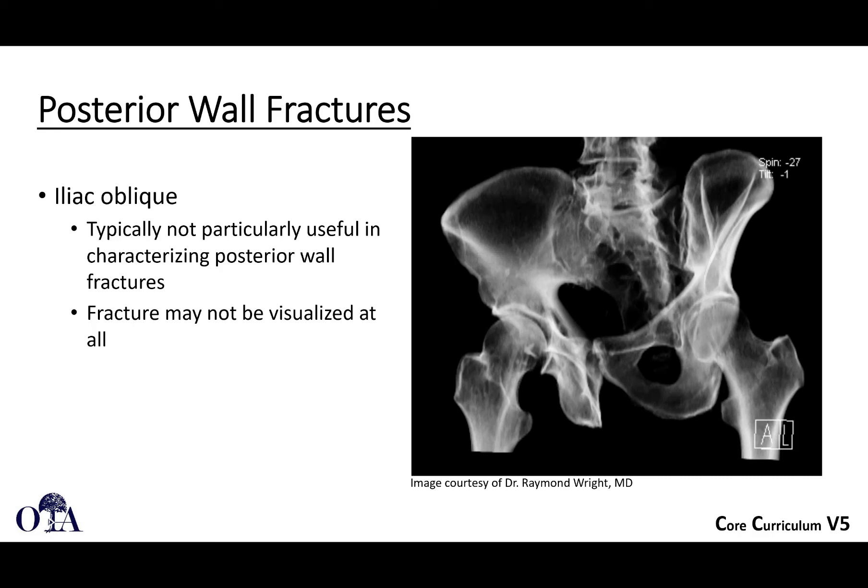On the iliac oblique, what you will see is that the posterior column is intact typically — that line is not disrupted.